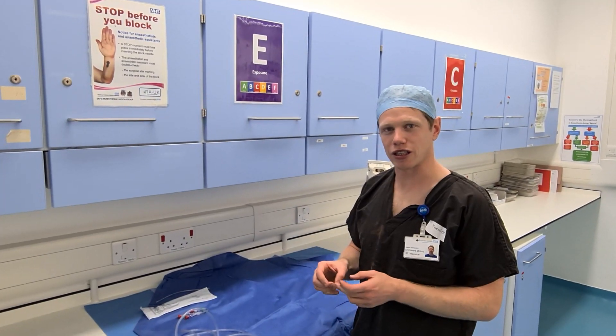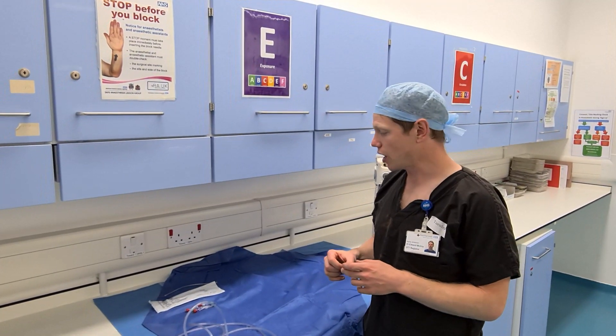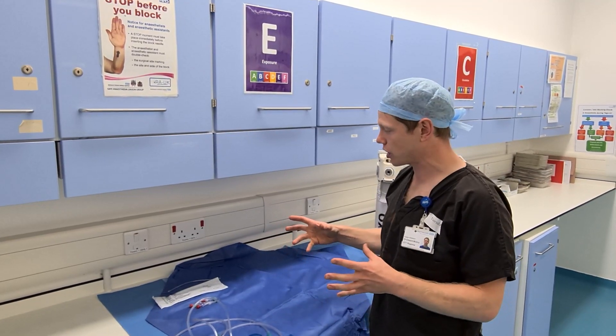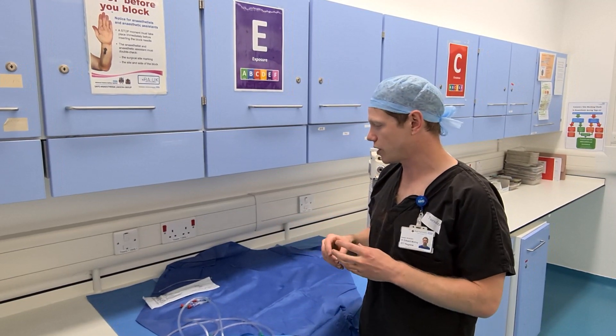Hello, I'm Ed. I'm a ST7 anaesthetic registrar here at the Royal Free Hospital in London, and we're going to show you today an atomisation technique for awake fibre-optic intubations, or airway topicalisation prior to instrumentation.